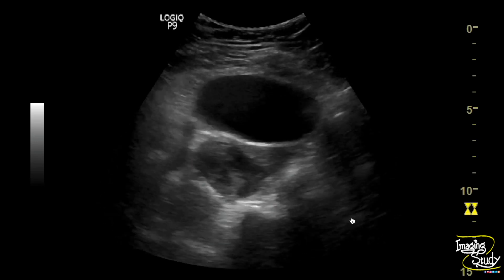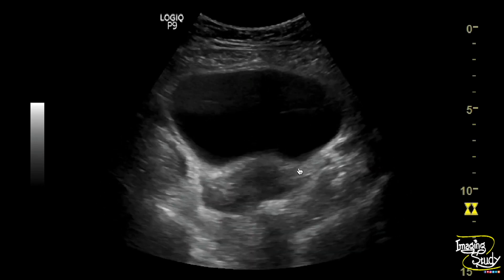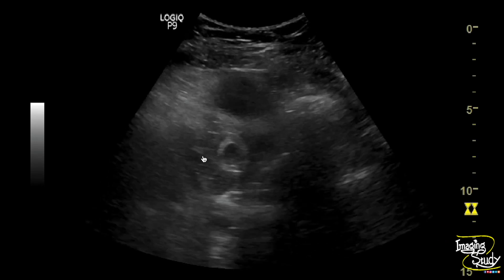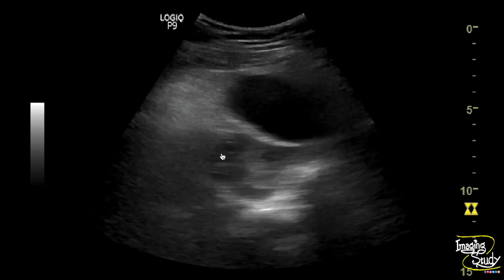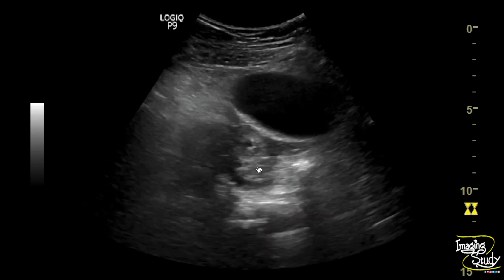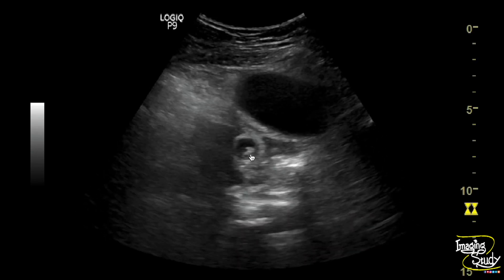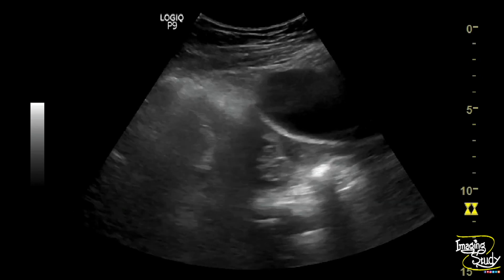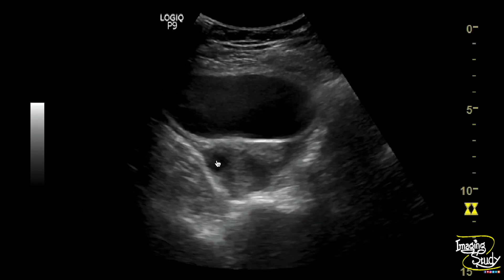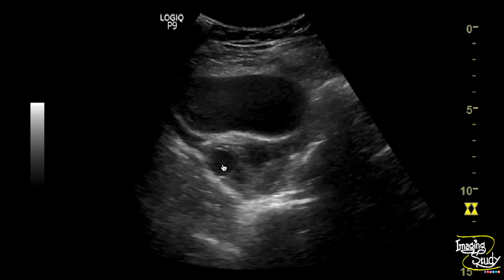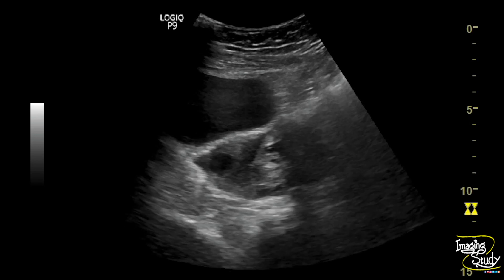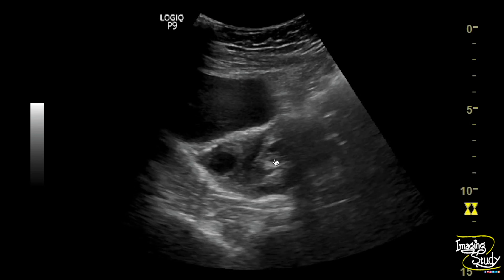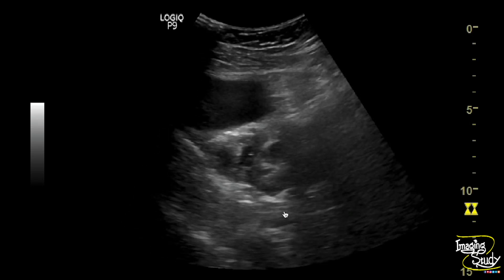Here you can see the uterus looks quite normal in transverse section. In the right adnexa, the cystic lesion shows an embryo inside. There is another cystic area — that is the corpus luteal cyst. The embryo shows a tiny cardiac pulsation, confirming this as a live ectopic pregnancy.